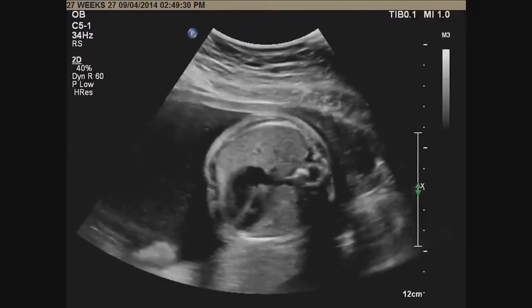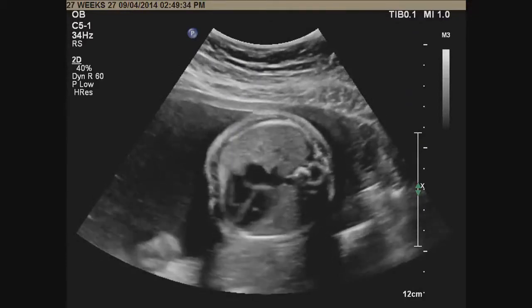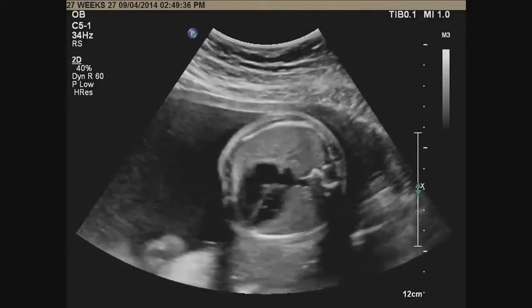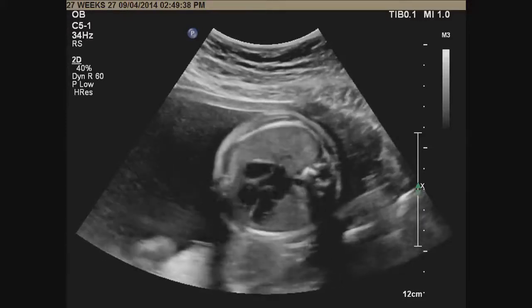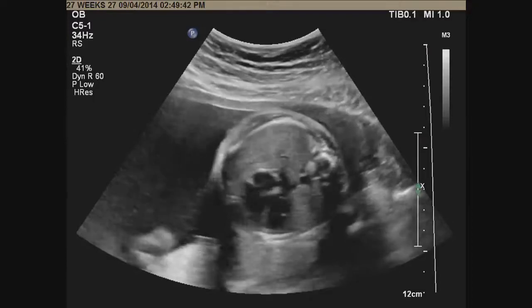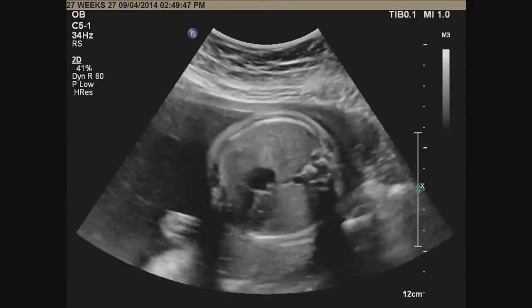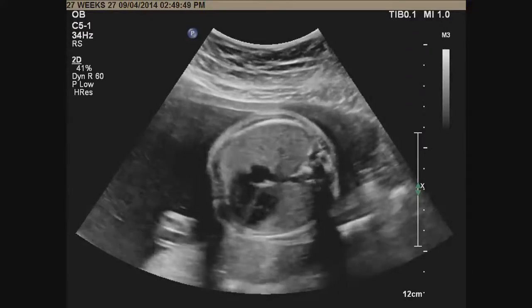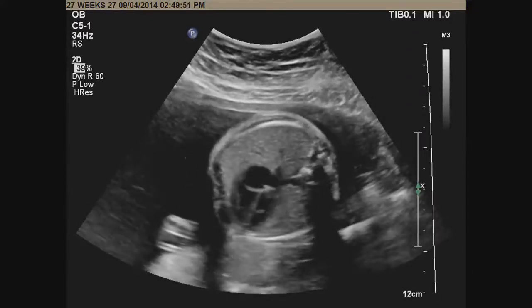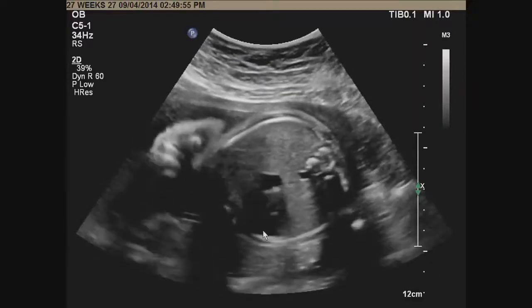So I look at the heart while I'm going down transversely now. I look at the cardiac axis also. I don't measure on every scan, but I semi-quantitate by looking at it. See, this is about 45 degrees. So this is a normal cardiac axis, and the apex of the heart is on the left side. So let me just rest my arm here. So that's the apex of the heart, the cardiac axis.